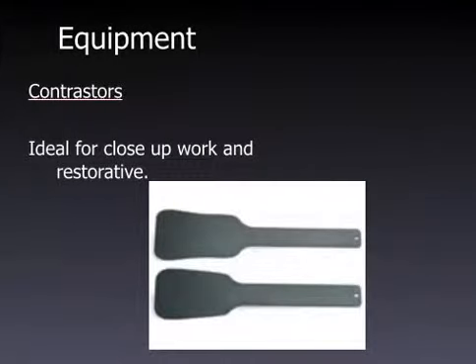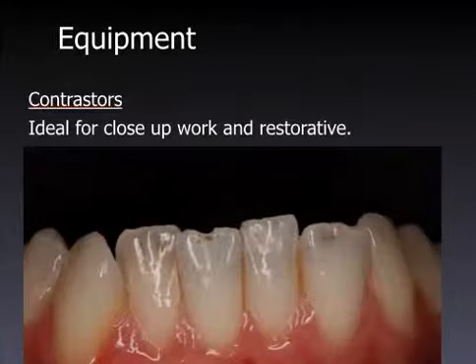And contrasters. These help create a nice background so there's no tongue in the way. So here we can see the lower incisors with a uniform black background, so we can pick up quite easily the incisal edge morphology.